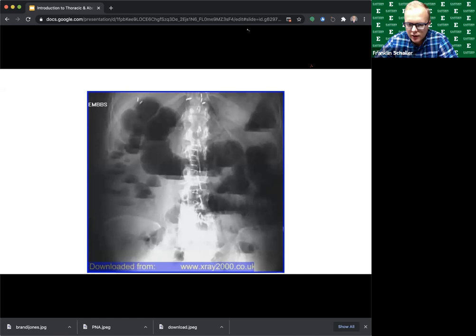So here's a clinical scenario. Here's an abdominal x-ray. So we've got a 34-year-old male vomiting at least 10 times prior to arrival, has 9, if not 10 out of 10, diffuse abdominal pain, and last bowel movement was 6 days ago. This is an example of a small bowel obstruction. You'll see a lot of that dilated small bowel is more central on that x-ray. So I see quite a bit of dilated bowel loops, and I'm going to be suspicious of a small bowel obstruction. Given this image and my clinical judgment from the scenario that I just presented, I'm going to be sending this patient perhaps into the hospital if they're not already there for further evaluation and treatment.